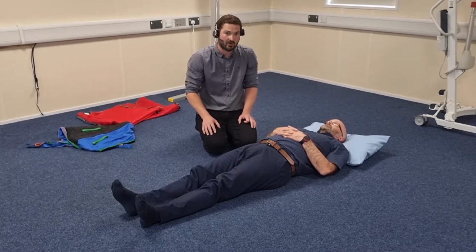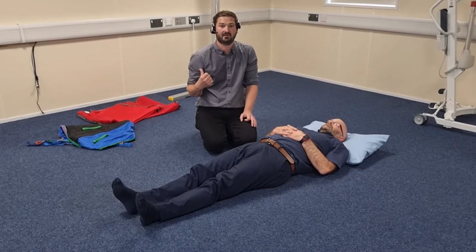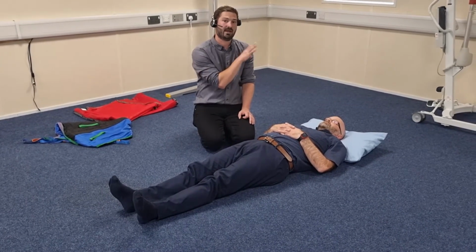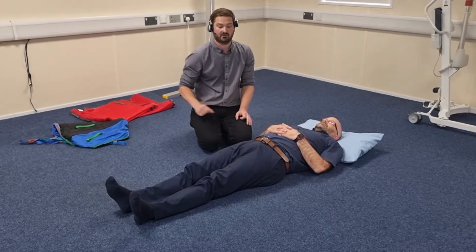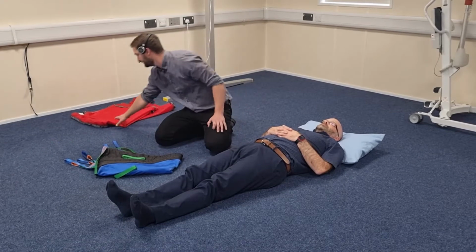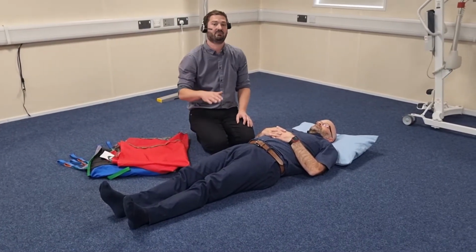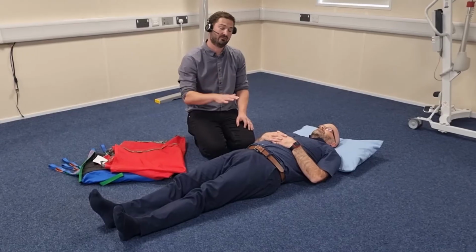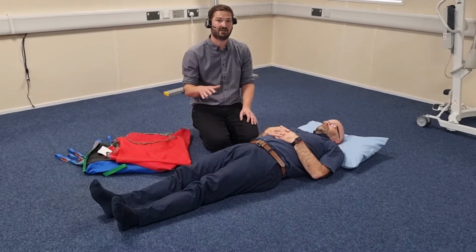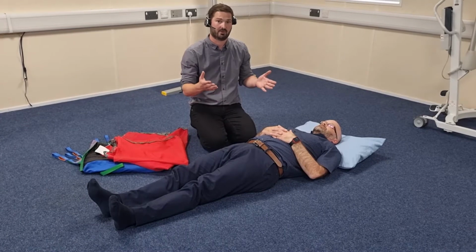So now we're going to look at hoisting a person from the floor with a mobile hoist, a full-bodied sling and two flat slide sheets. I'm going to be demonstrating bringing the hoist in from the head end of the person. So initially we're going to be looking to fit the sling and the slide sheets. We're using slide sheets to create a barrier between the person and the static surface. The low friction material will reduce shear and friction against the person's body while they're being lifted up off the floor.